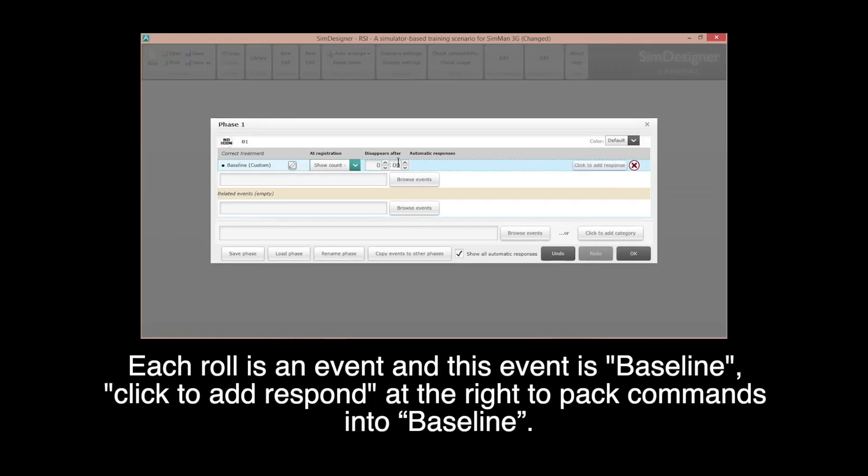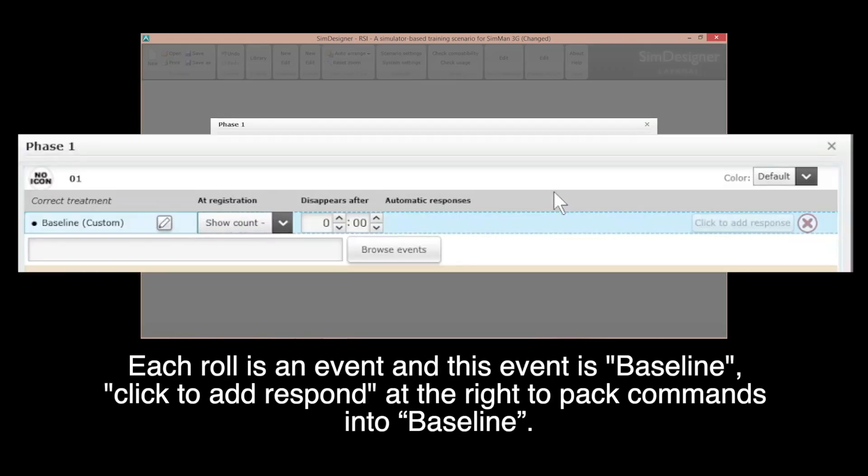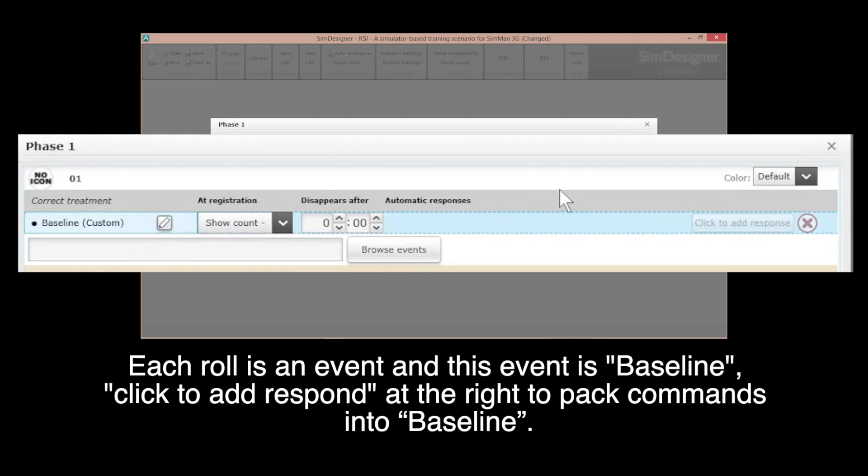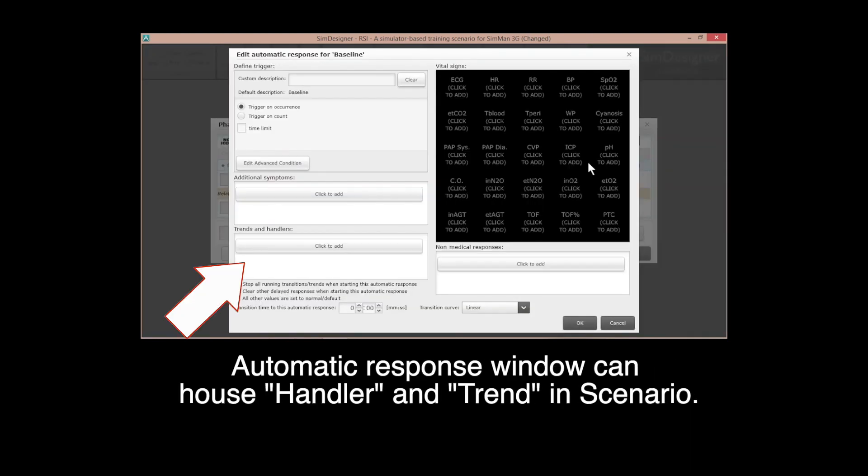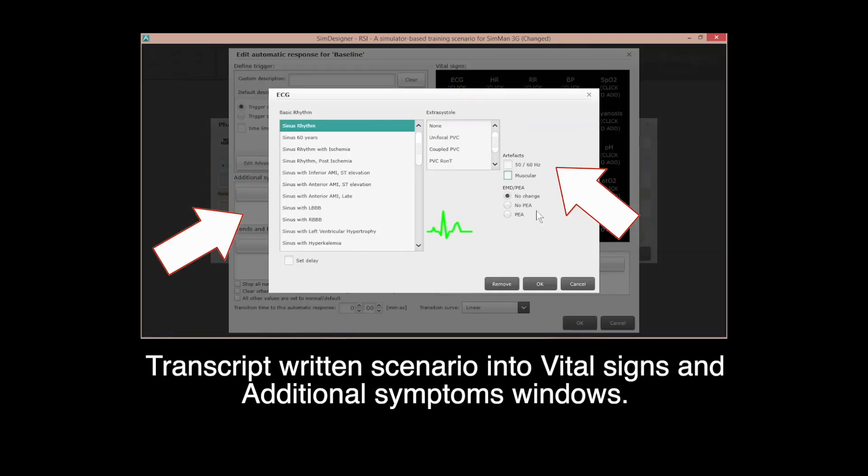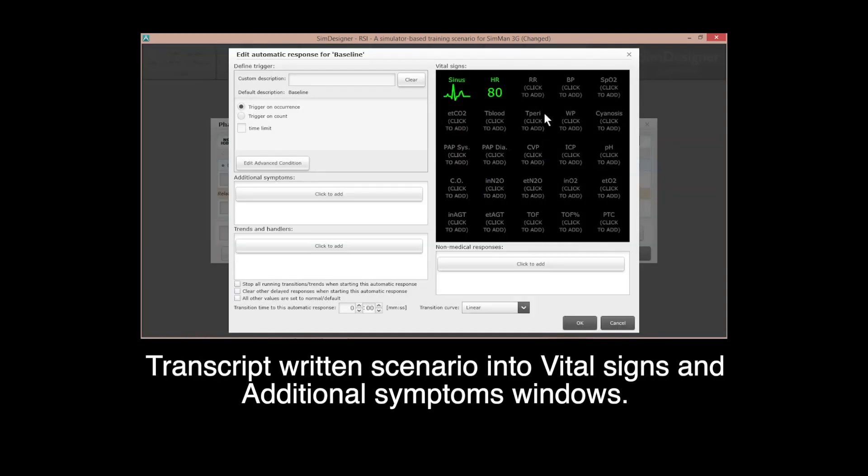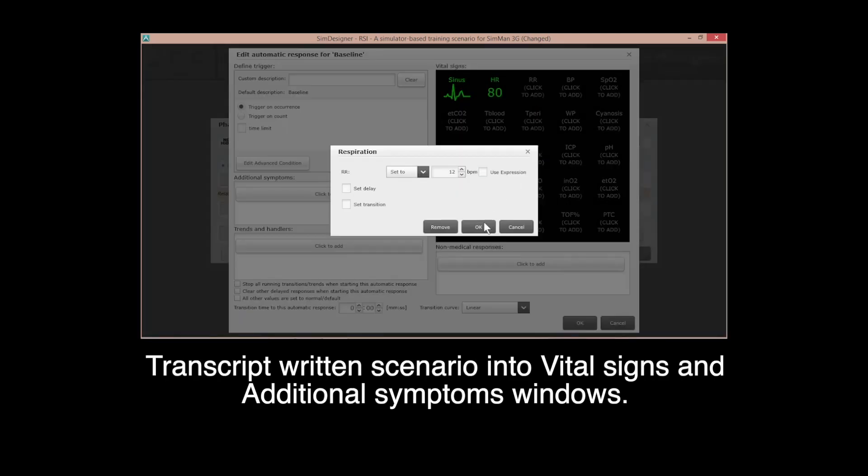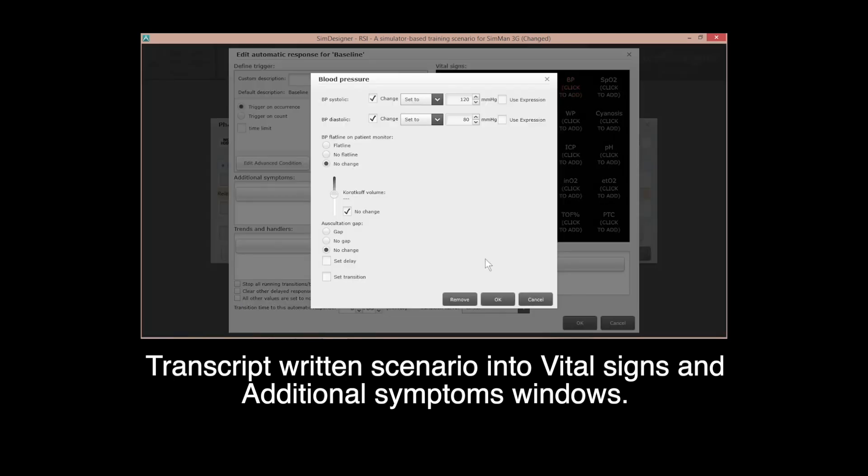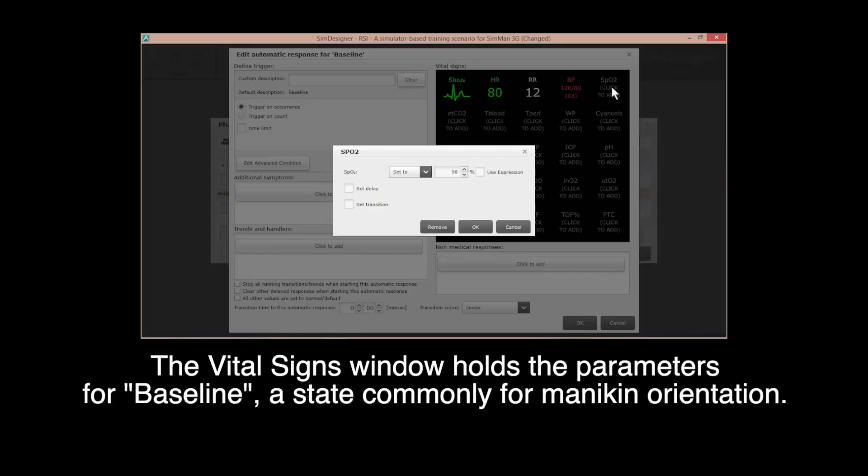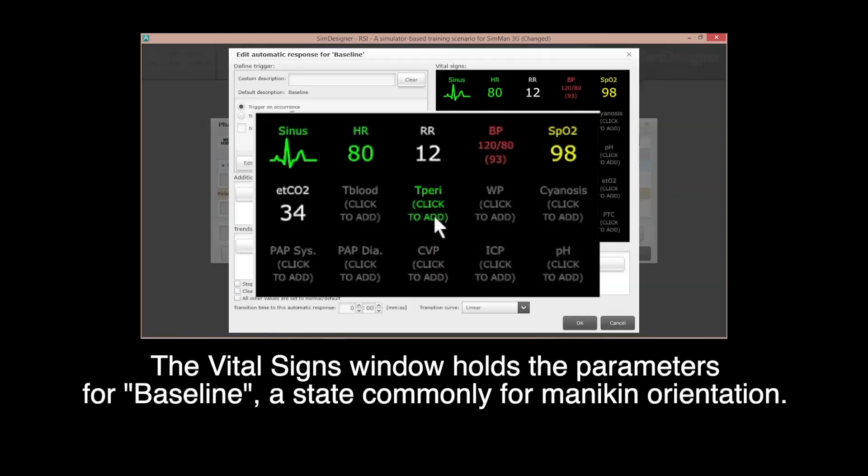Each row is an event and this event is baseline. Click to add response at the right to pack commands into baseline. Being here, automatic response window can house handler and trend for complex commands in scenario execution. Transcribe written scenario into vital signs and additional symptoms window. The vital signs window holds parameters for baseline, a state commonly used for MANIKIN's orientation.